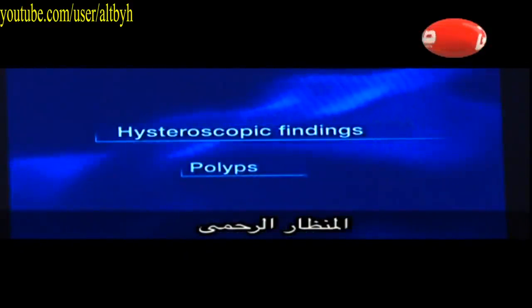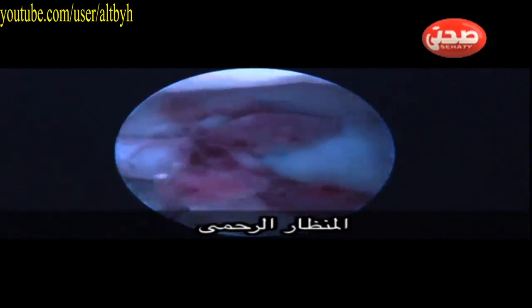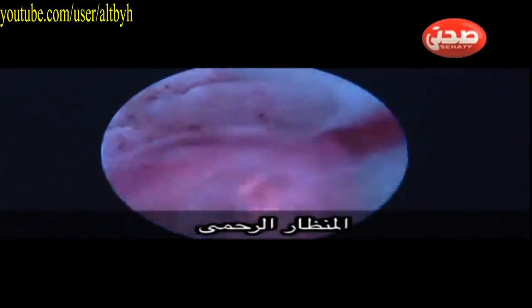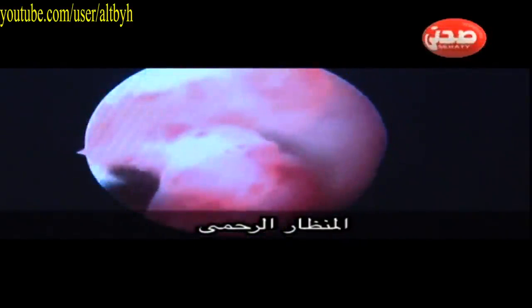In this case, there's another submucous fibroid in this postmenopausal patient. Polyps are very common in hysteroscopy, and as you can see here, this is a polyp in a lady with menstrual disorders. The polyp is pedunculated, and you can easily remove it. This is another example of a polyp protruding to the lower part of the cavity, and as you can see on the top, this is the fundus and both ostia. The polyp can also be easily removed by polypectomy or resectoscope.